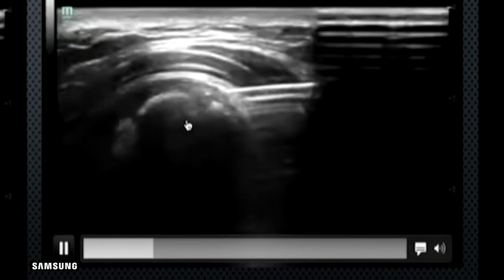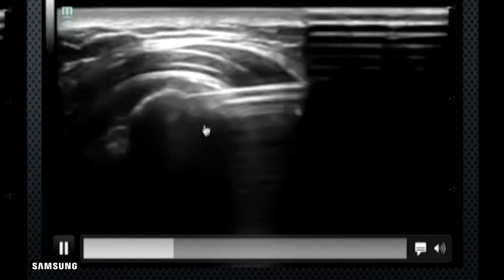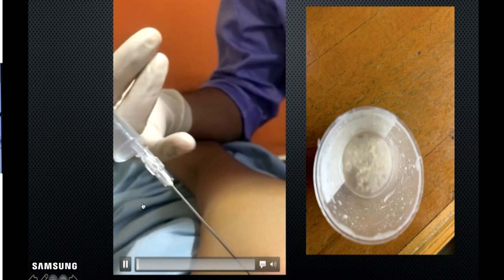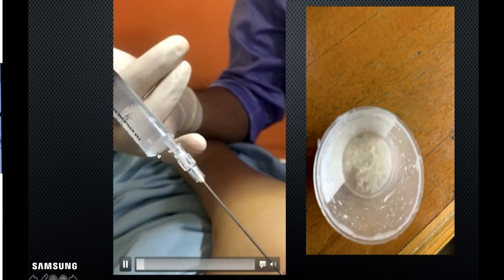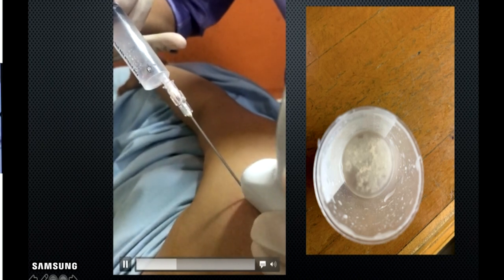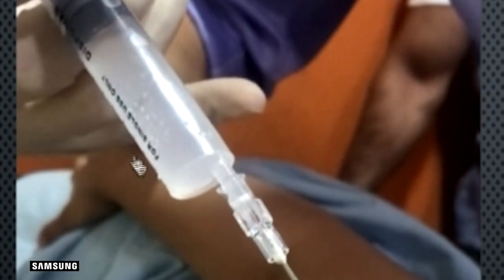Once inside, start pulsating first with 2% lignocaine. The inner part of the calcification slowly breaks down and comes into the syringe. Then repeat alternately with saline. When pulsating, you can see a puff of smoke — that's the powder of calcification dispersing. Some amount of the calcium powder gravitates to the bottom of the syringe, and the saline becomes more turbid.